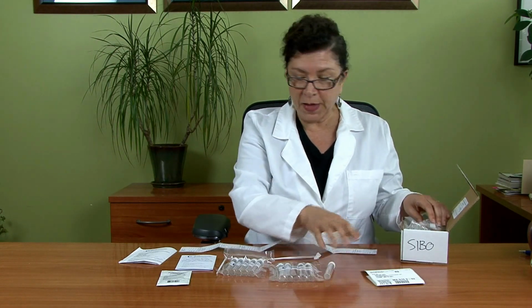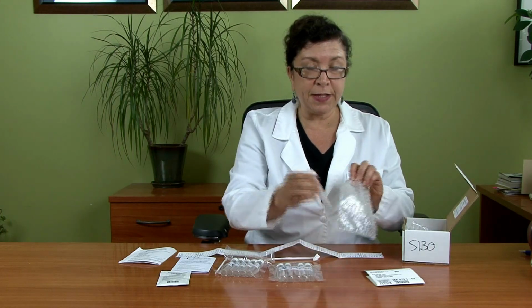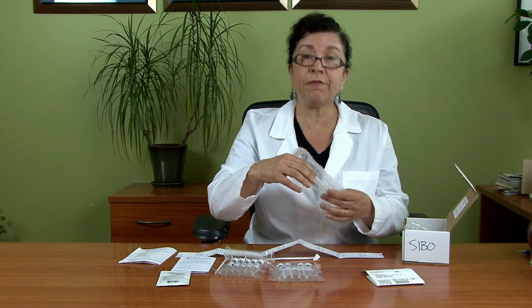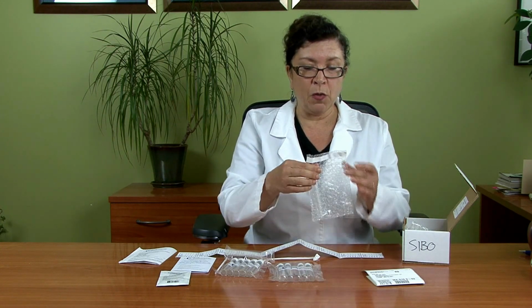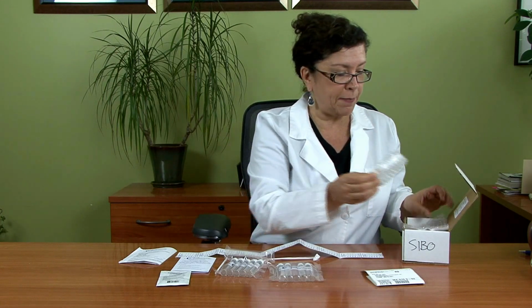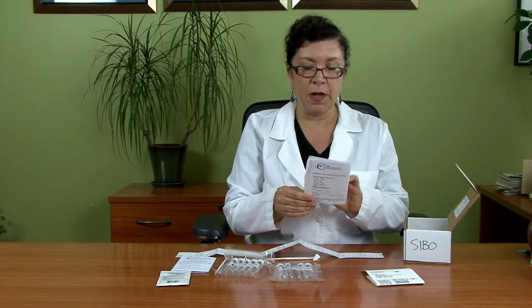Once you're through and they're all properly labeled, you're going to put your test tubes in here. So each one of these plastic wrappers is going to hold 5 tubes. Once it's done, you seal it up, so you should have them completely filled back up. Put them inside the test kit. Do not forget your lab requisition.